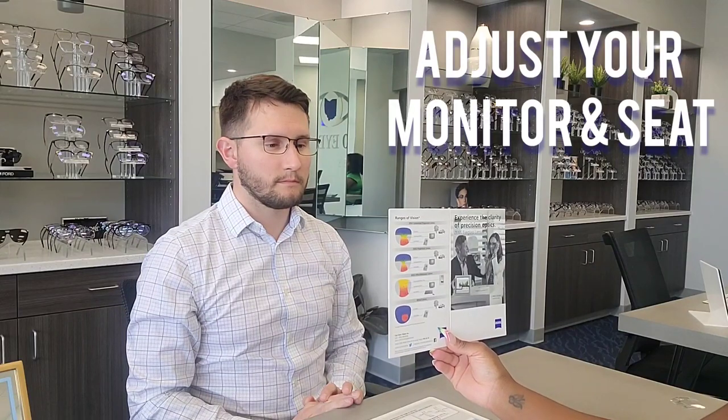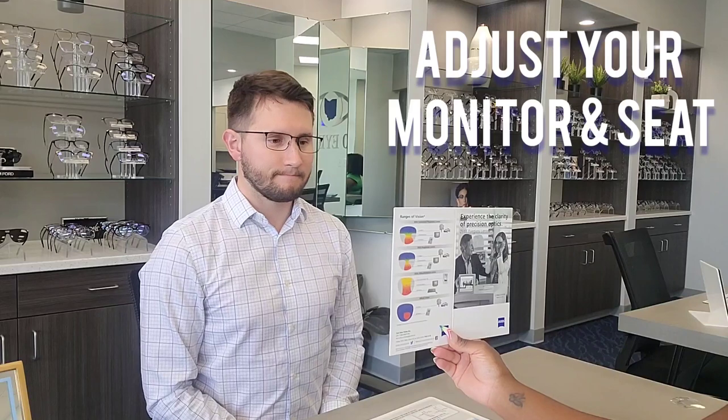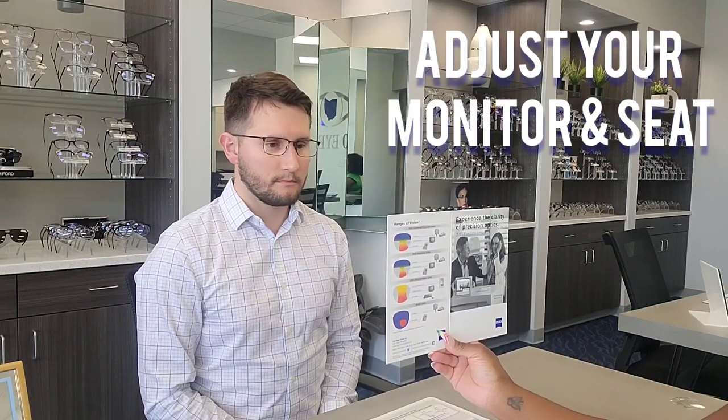Next we've come back over to the table, and we'll do computer, which is my favorite because it's where most people struggle. So if you're at work and your monitor is here at eye level, that is looking through your distance, because your distance is at your line of sight at the very top. So that's going to be blurry for you. What you should do is lower your monitor or raise your seat so that you are looking at a downward angle through the middle portion of your lens where the intermediate is. So remember — up here, blurry; down here, clear — for the computer.